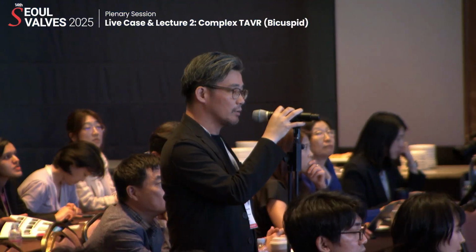Thank you so much. Actually, I would like to try to minimize the PVL as much as possible. That's the reason why I always prioritize SAPIEN over Evolut for the case with bicuspid valve. And if the case has aortic calcification, I would choose Evolut to avoid annulus rupture.